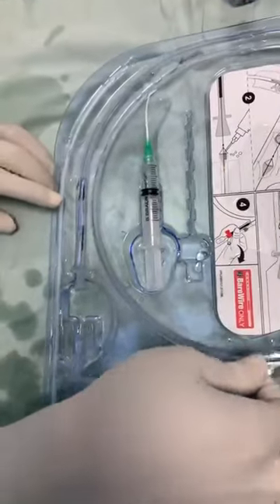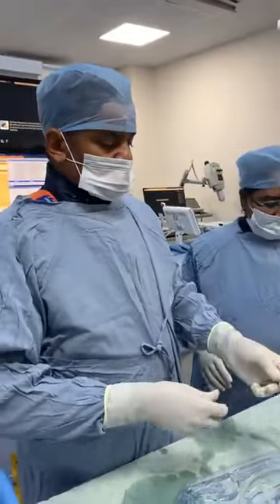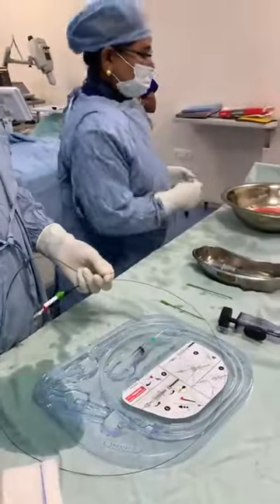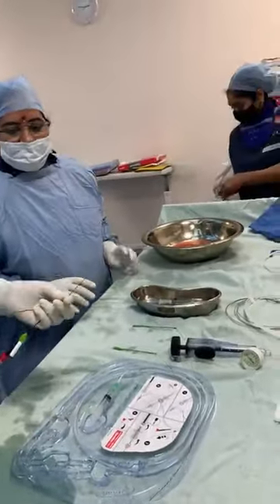We will show you once we take this device out. So this is the NAV6, the distal embolic protection, which will go inside. We give a little shape to the wire so that we are more comfortable when navigating it further. Yeah, so gentle J.